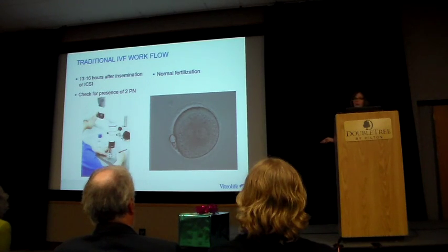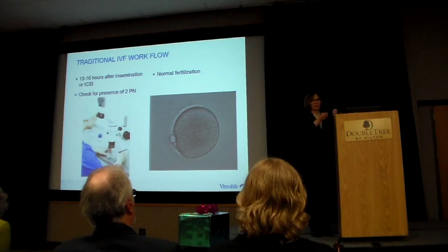So we would look here. We go get the dish out, take it over to the microscope, look, write down yes or no, it was fertilized, and put the dish back. And we would do that the morning after the day of your retrieval.